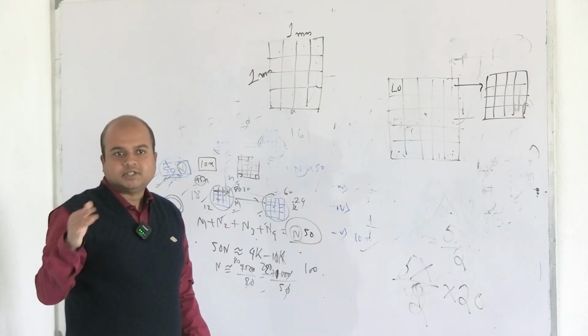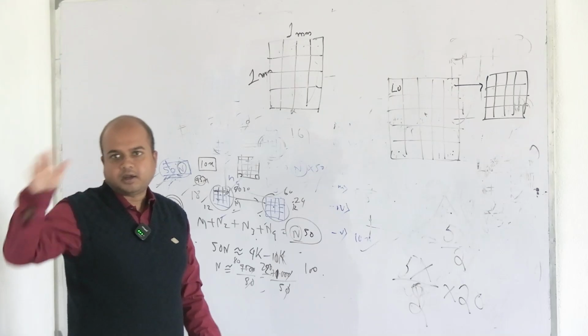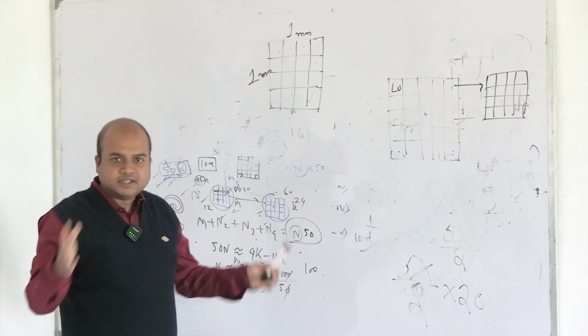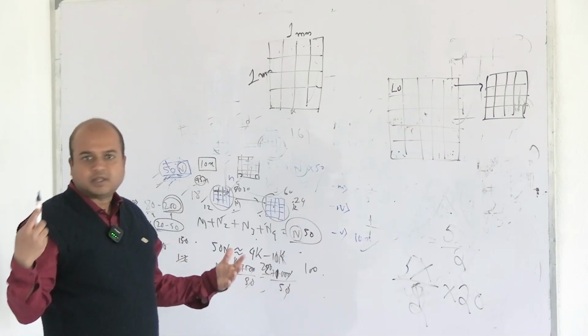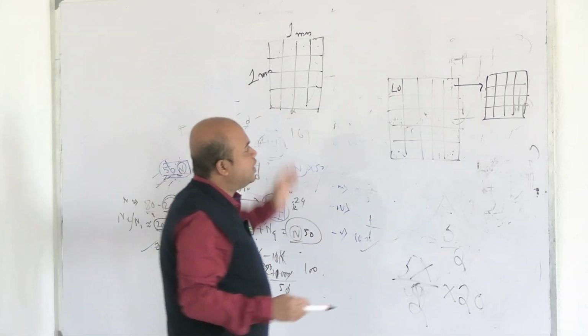As soon as you count, we move through the triple line square. Just imagine it, just think it in your mind, the picture, the grid. So we move, that square we just move to the right upper one, then we move down to the right, and it is easy to find out, because in between are the triple lines, the 1 millimeter into 1 millimeter, that triple line square, which is not for any counting. So it is easy to find those also.